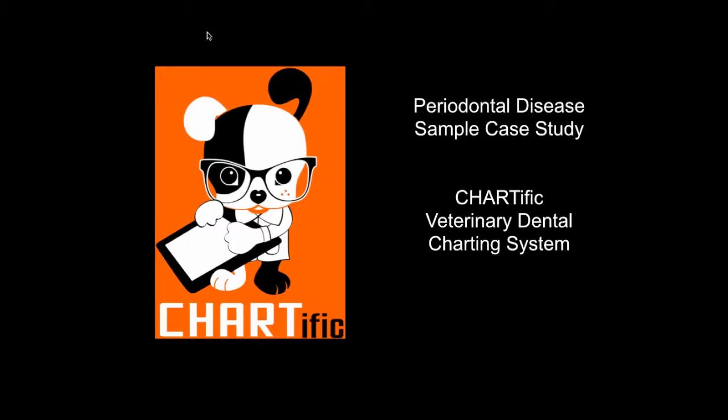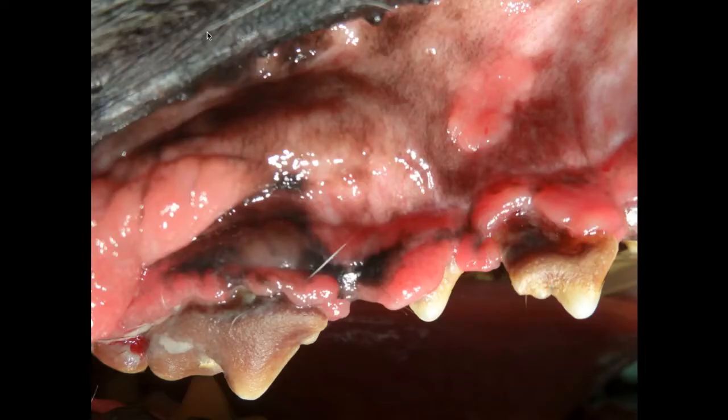Let's take a look at an example using the CHARTific veterinary dental charting system of an actual case with periodontal disease. We'll look at the gross image here. You can see that the fourth premolar rostral to the second premolar, along the margin of the gingiva, there's severe inflammation present.